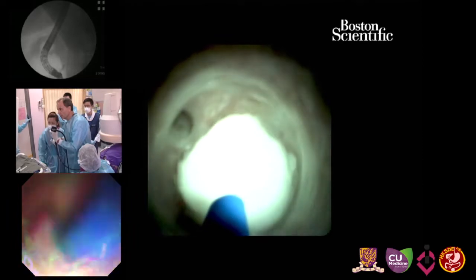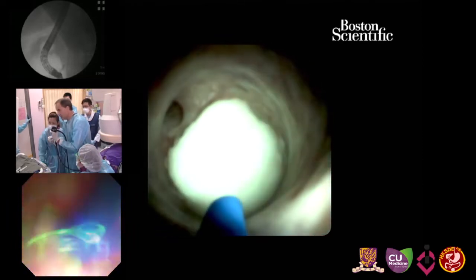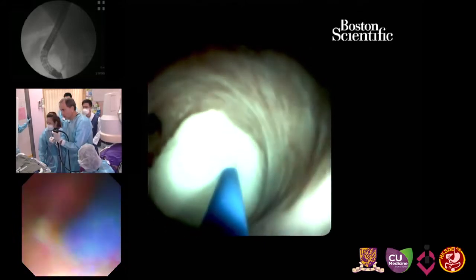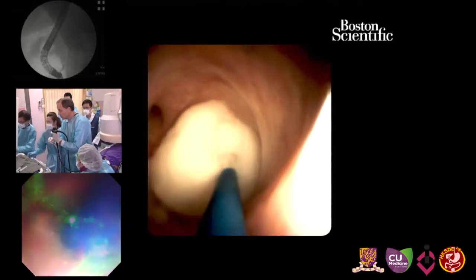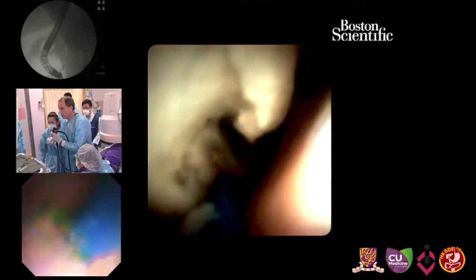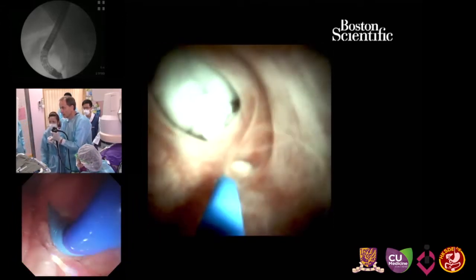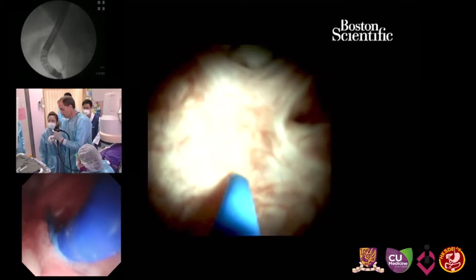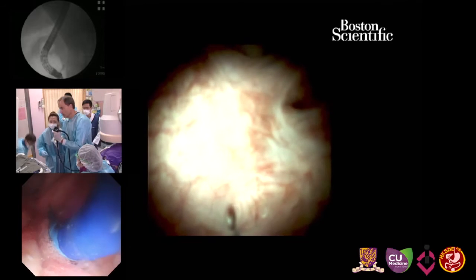I hope you appreciate side branches, and the stone is in the main duct. It is. And I start to fragment. Switch, okay. You already broke a part of the stone. So we have to be very careful.